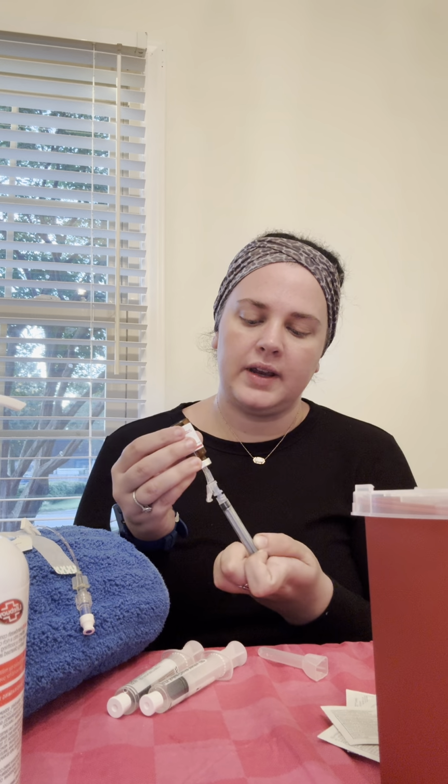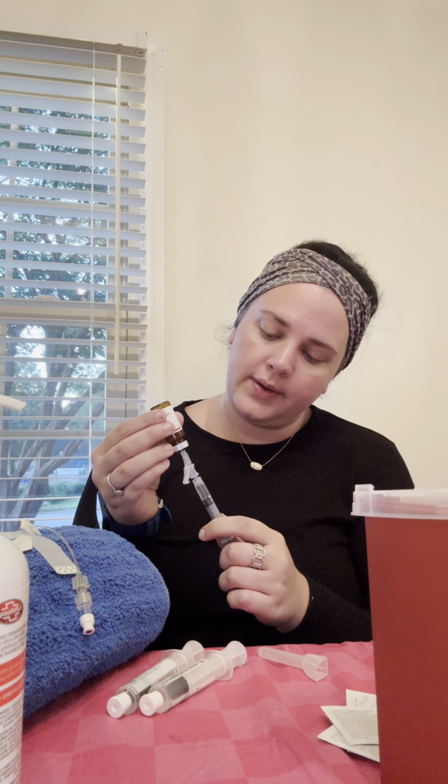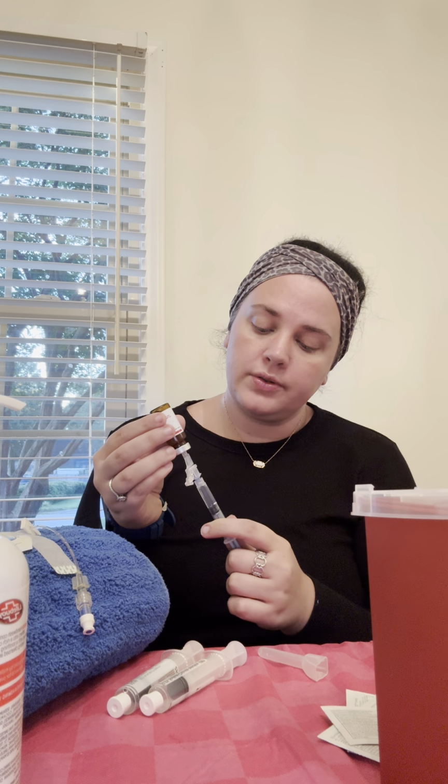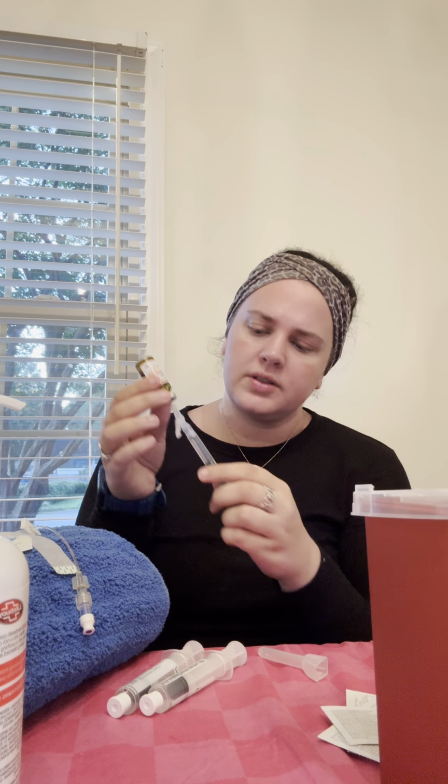All right, here is my syringe and my needle. Normally what I do, I'll go ahead and draw it up to 2. Push that 2 in. And then I'm going to draw up because our dose, per the MAR, is 20 milligrams per 2 ml, and this is in a 10 milligram per ml solution of furosemide.